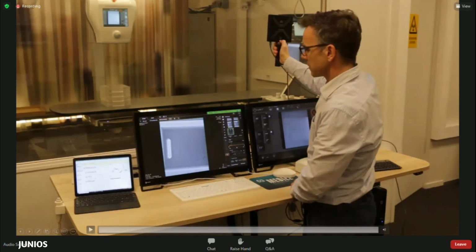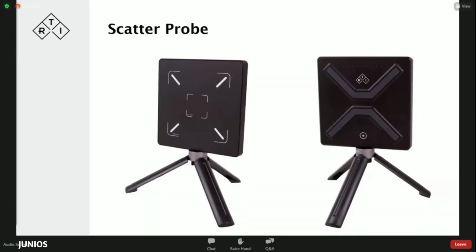Right. So there you have it. The instrument that we were using on those two presentations that we just had for scattering leakage measurements is the scatter probe. As mentioned a little bit earlier, this scatter probe has two sensory areas, the 10 cm squared and 100 cm squared, to comply with the requirements. And at the back of the scatter probe, you have the start stop button, and you also have LED lights that would indicate to you the intensity of the radiation.